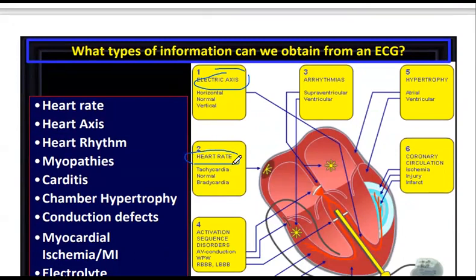It is above normal, normal, or below normal. Then heart rhythm. How are the heart rhythms? Do they beat continuously, or beat for 10 beats, stop and then continue, or continue beating more than the normal level?